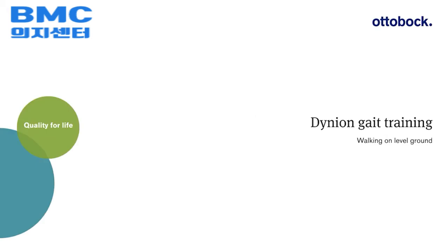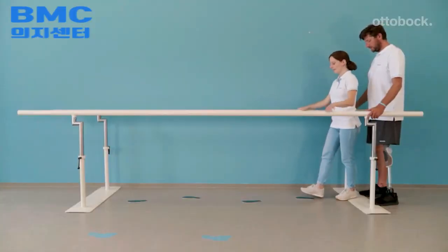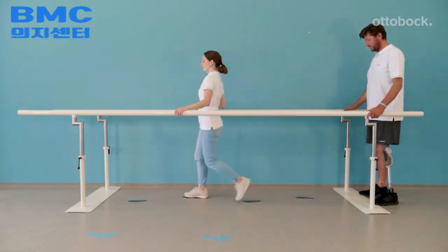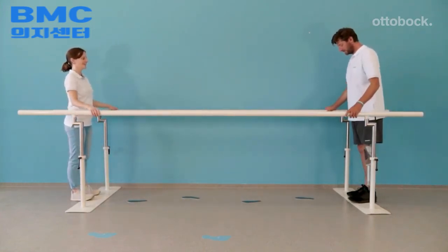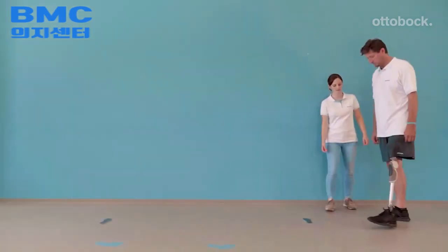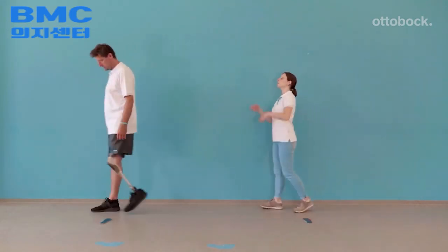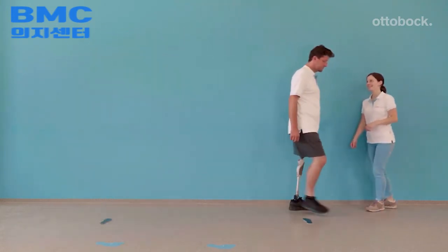To refine walking techniques, the following exercises can be used and adapted. Shown here is a technique to learn how to walk with an appropriate step length. In this exercise, the model walks around two markers in the form of a figure-eight, which helps him learn proper stance release.